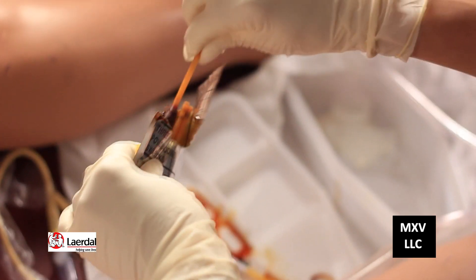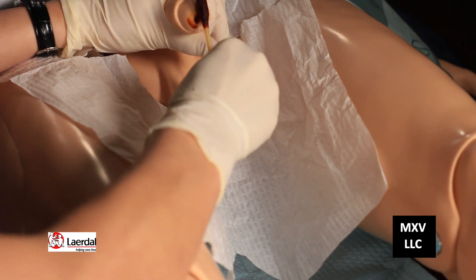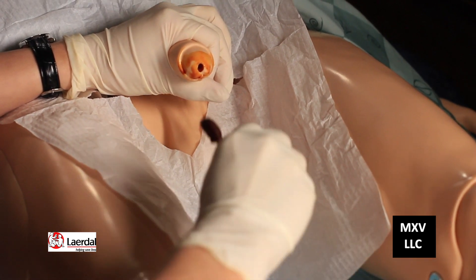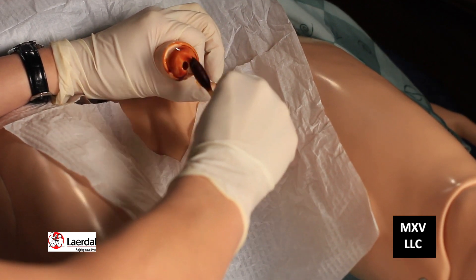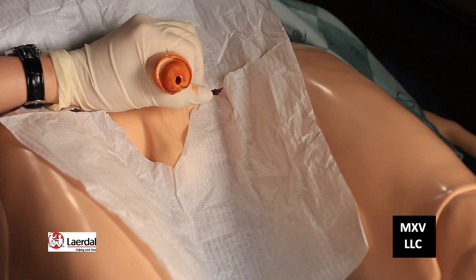These are your iodine swab sticks. We're going to use these to clean the urinary meatus. Take your iodine swabs and cleanse the urinary meatus. Take your non-dominant hand and hold the penis. If he's circumcised, you don't have to pull back the foreskin, but if he isn't, then you've got to pull back. Swab from the inside out and use all of them. Notice now your left hand is not sterile anymore.